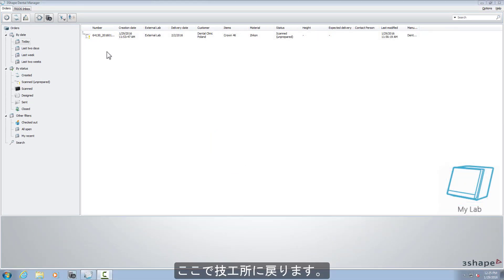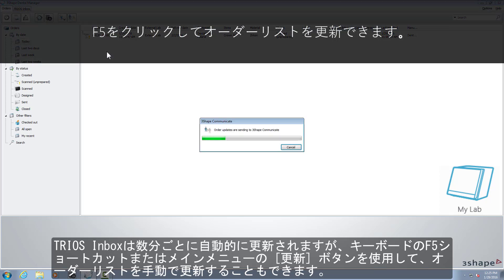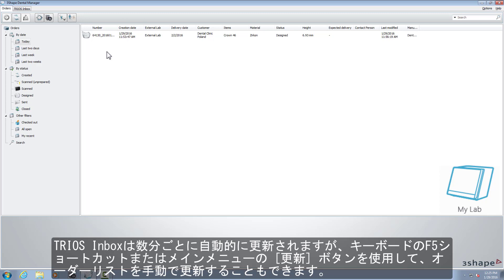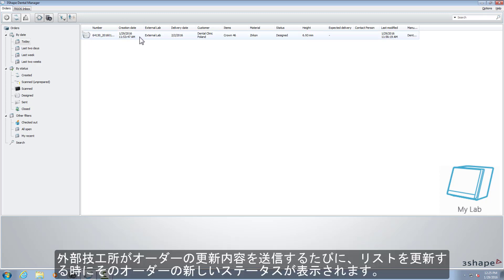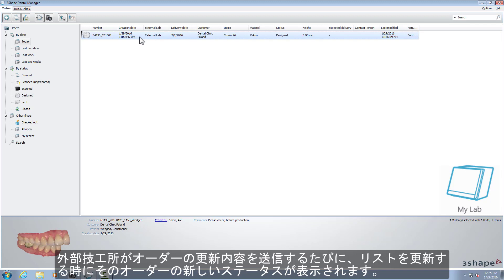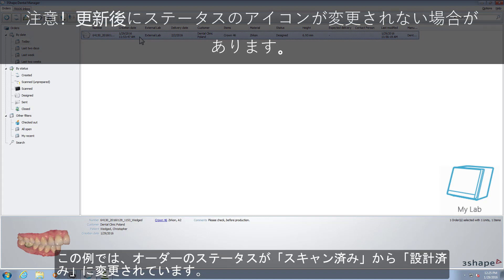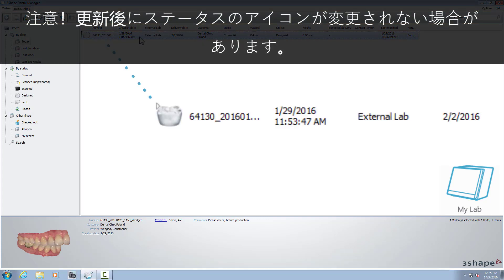Now we are back to the work lab. TRIOS Inbox is refreshed automatically every few minutes, but you can also refresh the orders list manually with the F5 shortcut on your keyboard or with the refresh button in the main menu. Each time the external lab sends you an update, you will get a new order status for that case straight after refreshing the list. In our example, the order status has changed from scanned to designed.